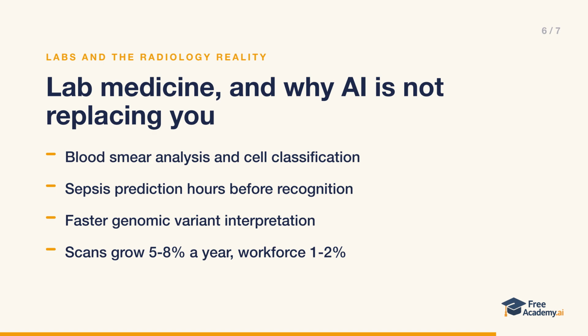That brings us to a common misconception. AI is not replacing radiologists. Imaging volume grows 5 to 8% a year, while the workforce grows 1 to 2%. AI helps absorb that gap by handling routine screening and flagging critical findings. So radiologists can focus on complex cases and clinical consultation. The same principle holds across specialties. AI does pattern recognition at scale. Clinicians provide judgment, context, and care.